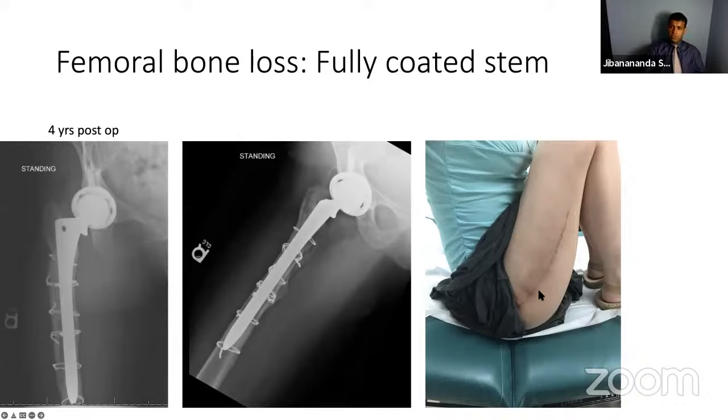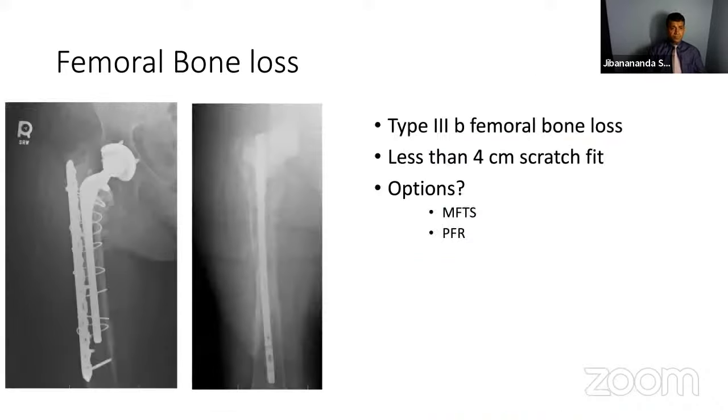She's got good range of motion. Unfortunately, she tends to bend over 180 degrees, hasn't dislocated. As you can see, it's nicely anteverted. That was our initial problem with recurrent dislocation. That's why we anteverted it enough, because she's obsessed with bending the hip this much, which I normally don't expect, but again, she's doing well with that.